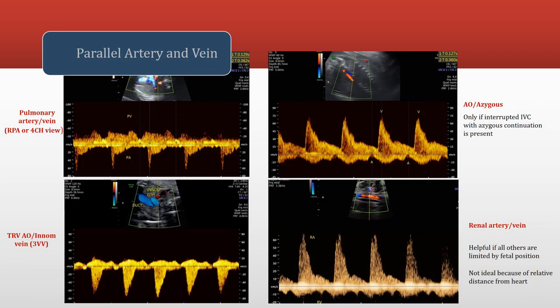Here are your options for parallel artery and vein assessment. You have your pulmonary artery and vein, your transverse aorta and innominate vein. On fetuses with an interrupted IVC, you can obtain the aorta and azygous vein. And in babies that are in a tough position or a little bit further along, we can even use our renal artery and vein to assess these intervals.